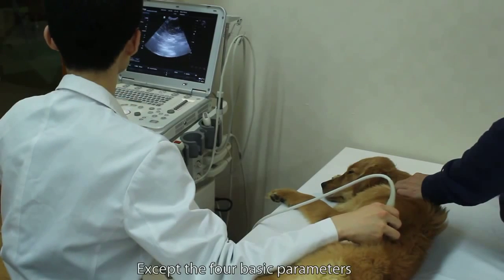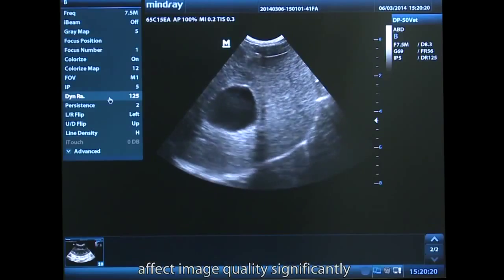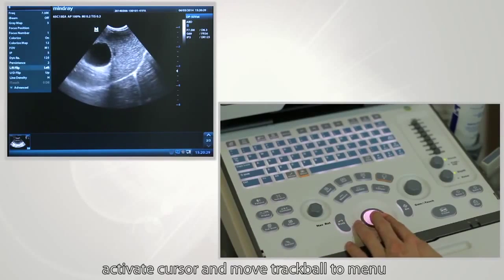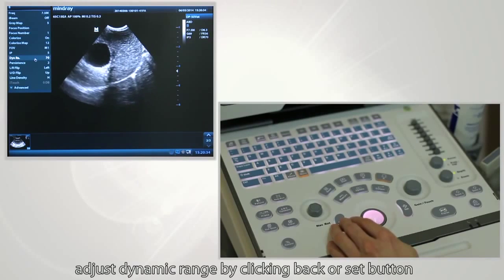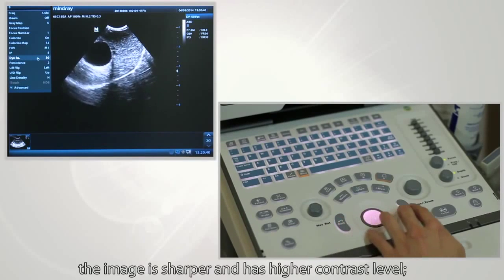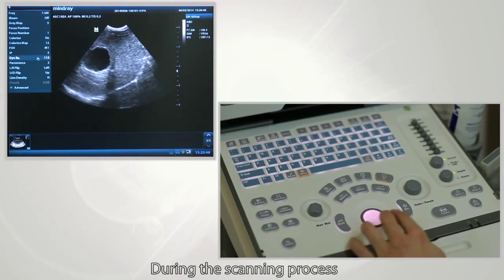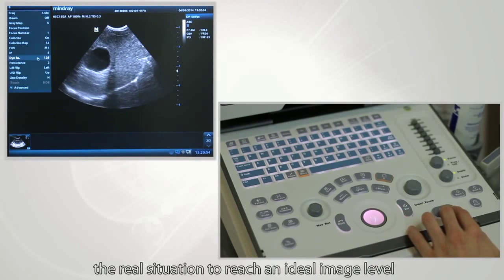Other than the four basic parameters, there are also other parameters that can affect image quality significantly. To adjust dynamic range, press the cursor button, activate the cursor, and move the trackball to the menu. Select dynamic range and adjust it by clicking the Back or Set button. When dynamic range is low, the image is sharper with higher contrast. When dynamic range is high, the image is smoother but with compromised contrast. During the scanning process, adjust these parameters according to the real situation to reach an ideal image level.